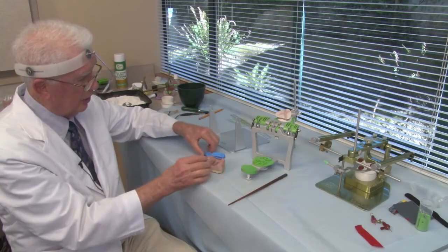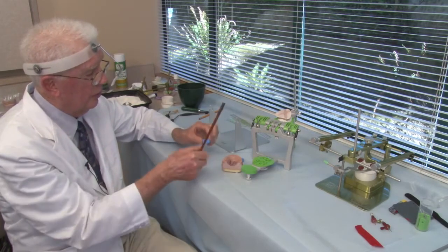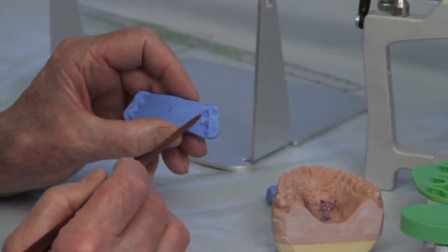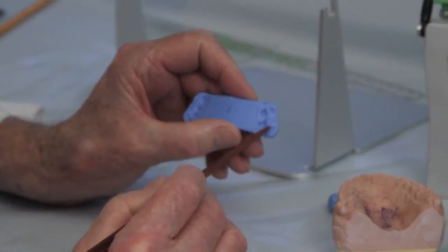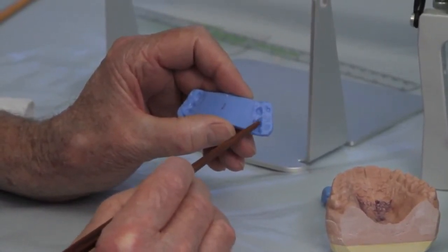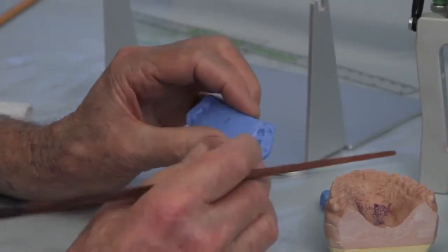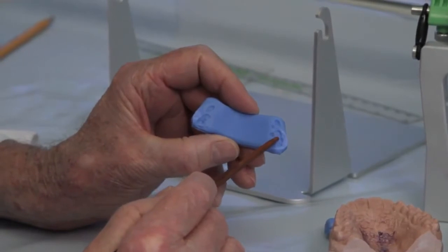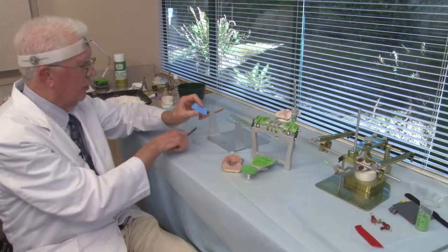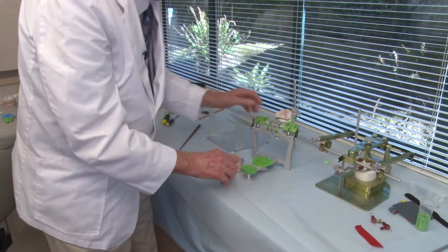Now I'm going to look at the posterior section. And when you cut the excess wax, quite frequently the wax will take an indentation of the central fossa area. You'll cut away some of that central fossa area, leave just cusp tips. So you cut away the central fossa area so that only cusp tips are seating. The same way on the lower, cut away the central fossa area here. And now I have just cusp tips. So I think my wax bites are prepared okay. And now we'll get ready to mount our lower model.